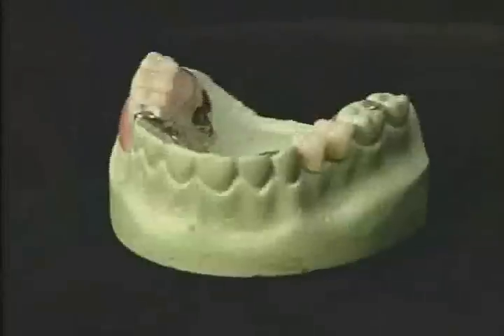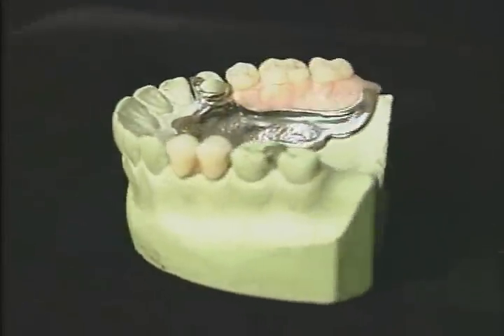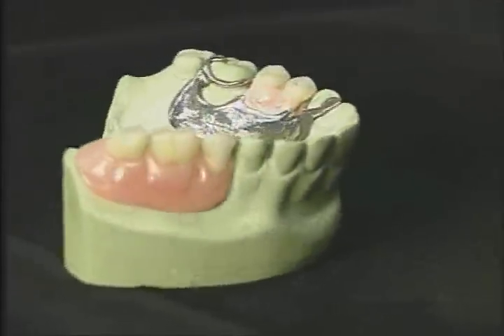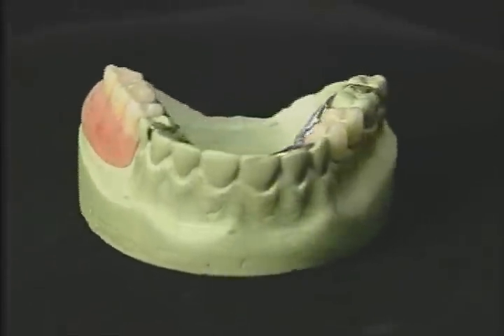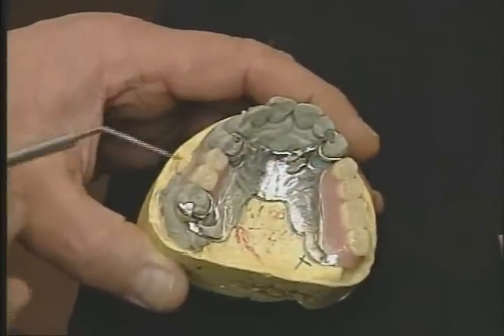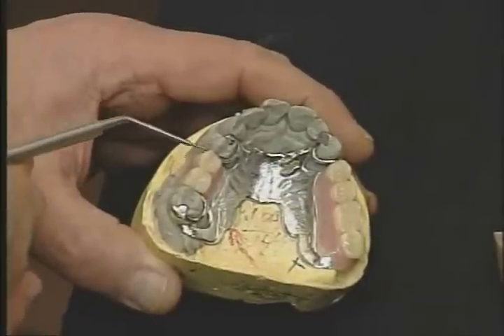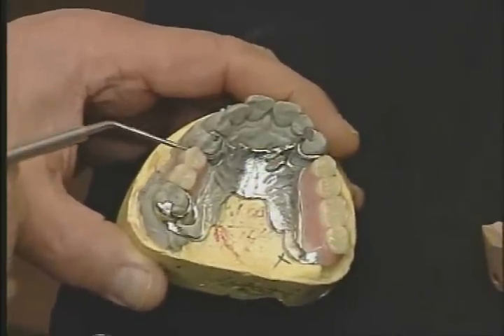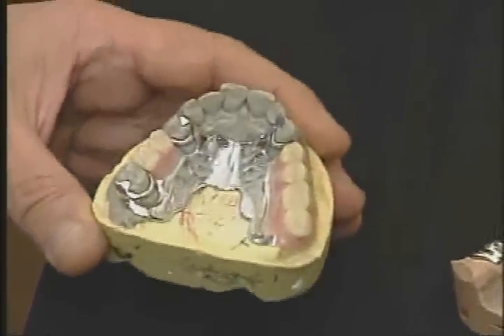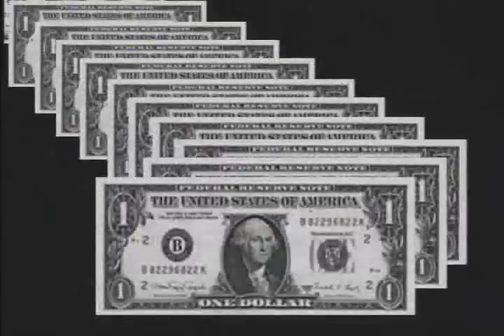Five, the partial must have a direct and easy path of insertion. Six, the partial must have built-in permanence with a minimum need for repair, and any repairs must be made simply and inexpensively. Seven, simplicity of design is most important. No unique skills or difficult technique should be required of the dentist or dental technician.